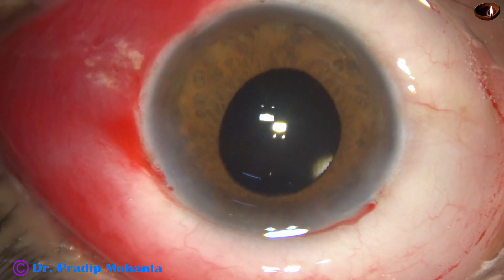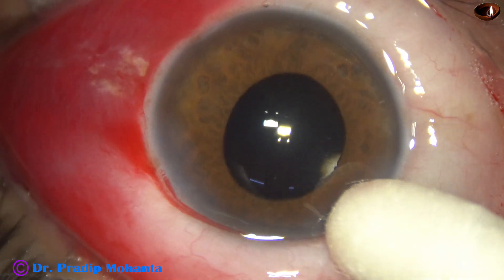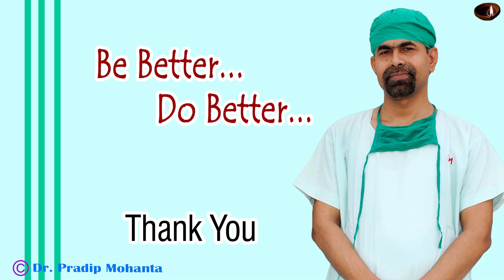The anterior chamber is nicely formed and the case is concluded. Thank you very much for your attention. Hope this video will help you in developing your surgical skills. Be a great surgeon and serve your patients with love, respect, compassion, and great surgical competence.